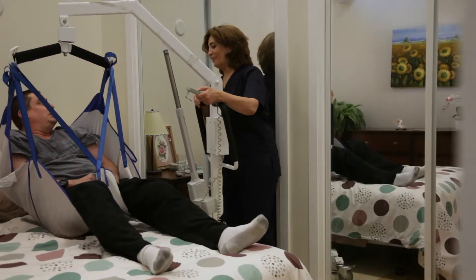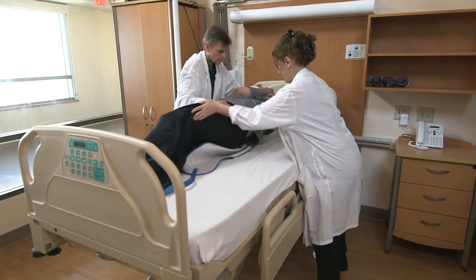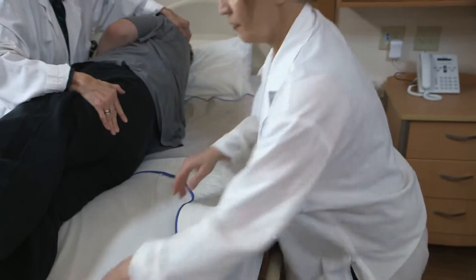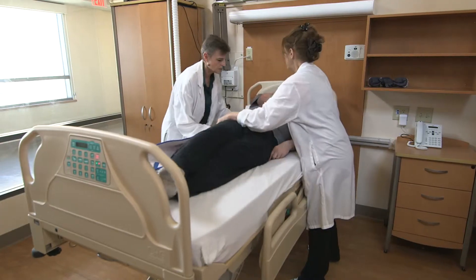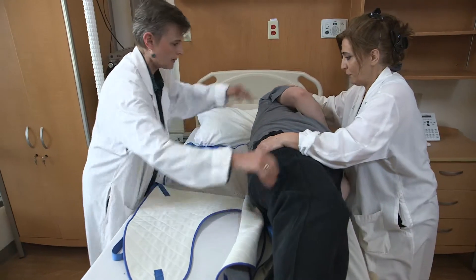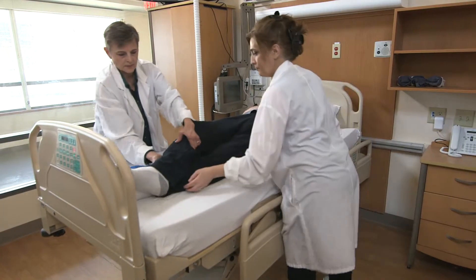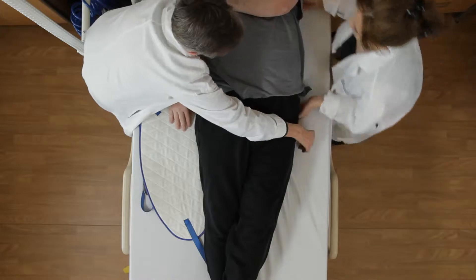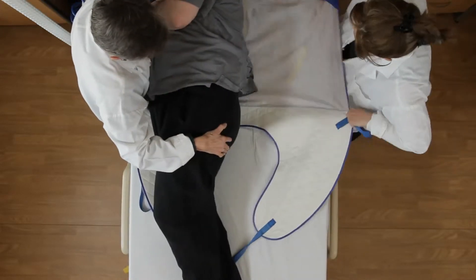The most common patient transfer tools are floor and overhead lifts, but both lifts require health care workers to physically move patients onto a sling for transfer. Most health care workers use the log roll method to assist the transfer. However, this requires a lot of bending, twisting, and lifting, putting caregivers at risk for repetitive injury. In all these cases, the risk of injury is further increased when dealing with bariatric patients.